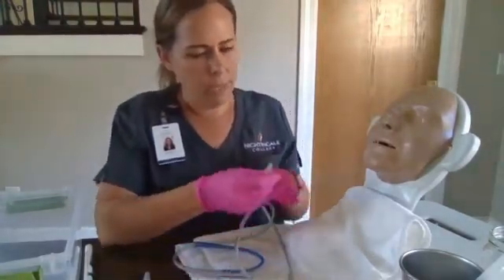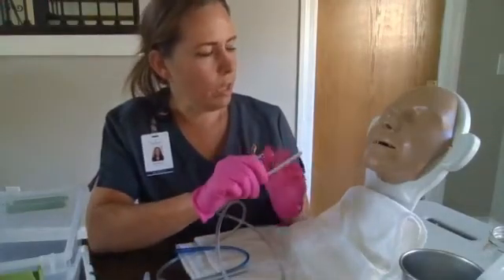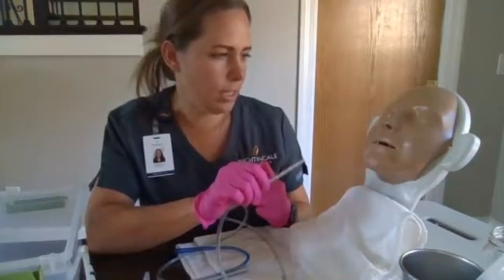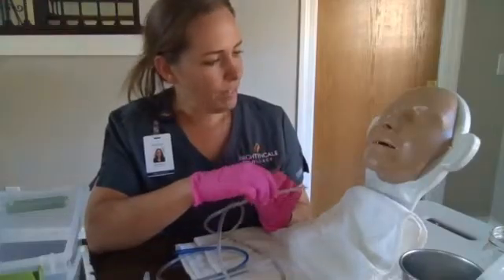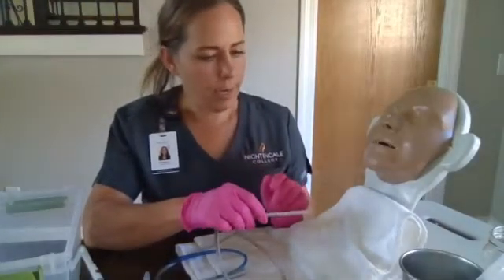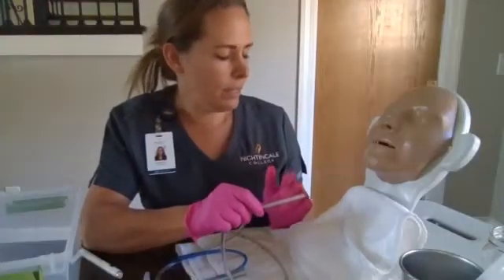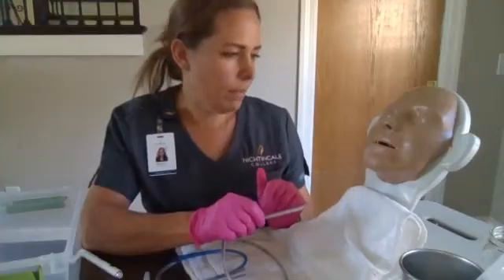Mr. Smith, I'm going to have you start by looking up. We're going to insert the tube into your nose. When it reaches the back of your throat, I want you to lower your chin to your chest and take some sips of water. Each time you swallow, I'm going to advance the tube a little bit farther. If for whatever reason you start to gag or you are having difficulty breathing, just raise your hand and we'll stop and give you a minute.